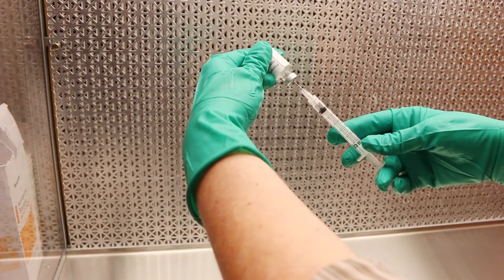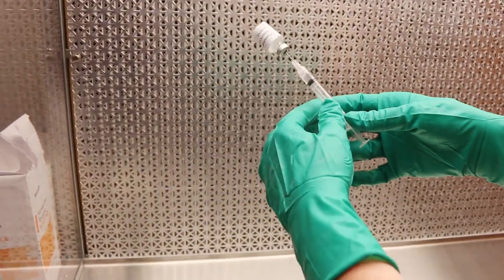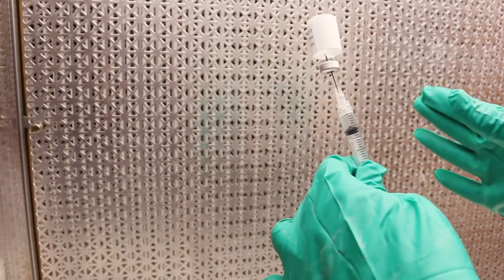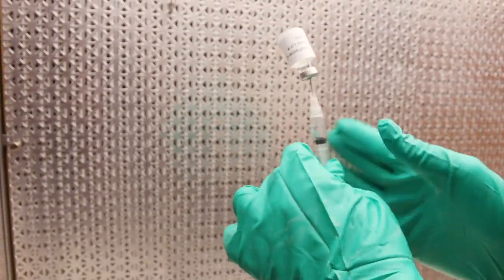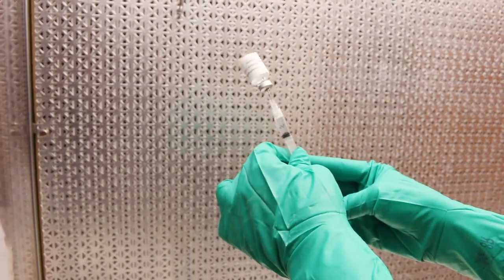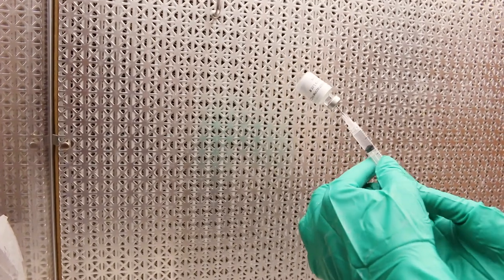Step twenty, remove slightly more than the desired dose and move bubbles to the top by bracing the syringe against your palm and tapping the barrel of the syringe. Step twenty-one, push the plunger on the syringe to expel air and any extra fluid back into the vial.